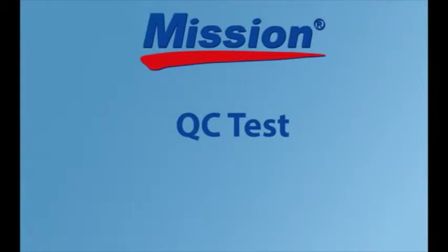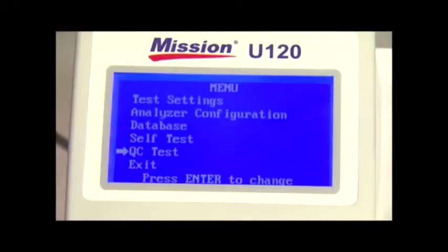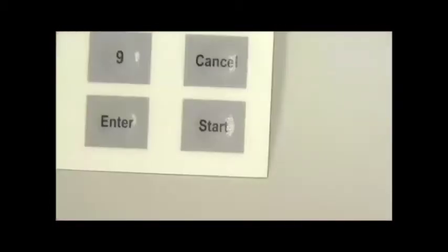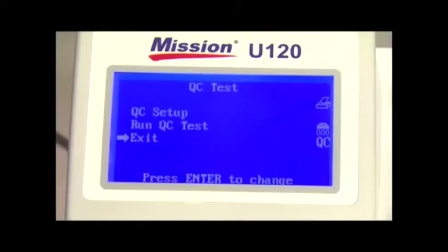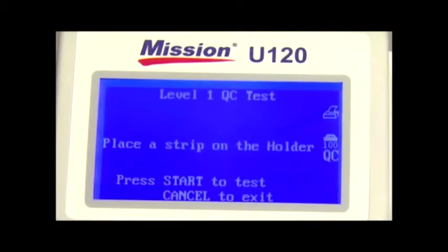The last option in the main menu screen is the QC test. Select QC test on the menu and press enter. This will allow you to run a QC test. Select run QC test and press enter to perform a QC test before the next scheduled test time.